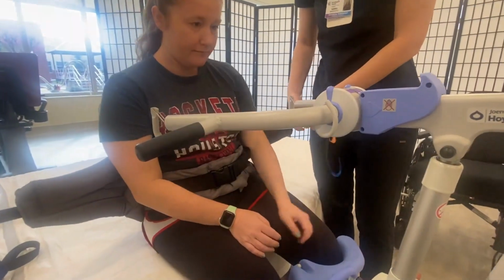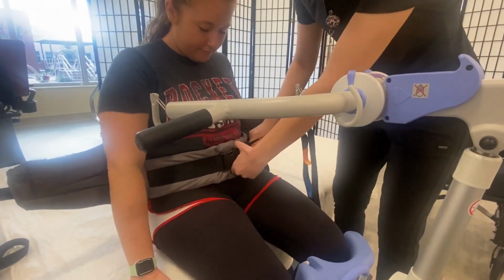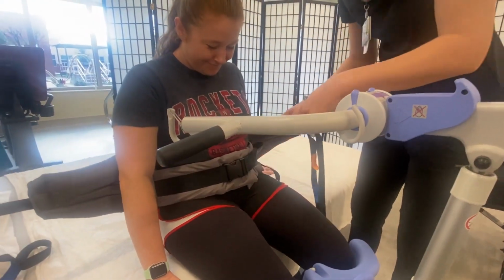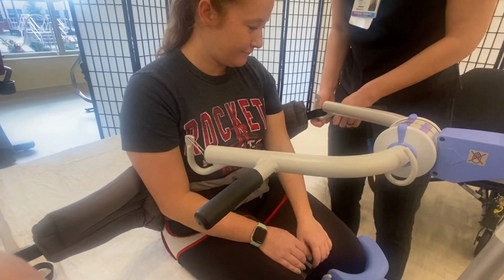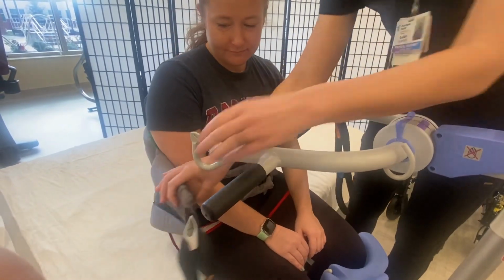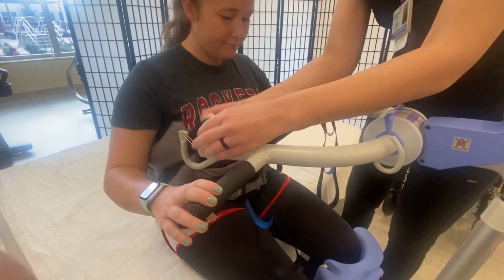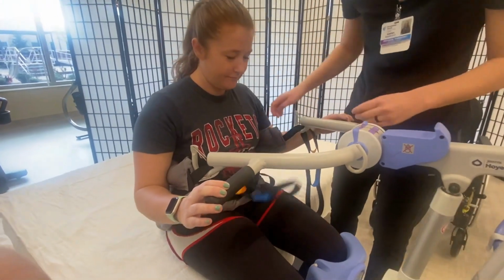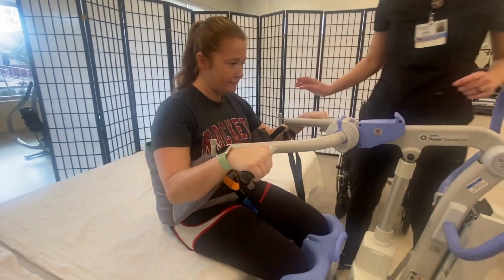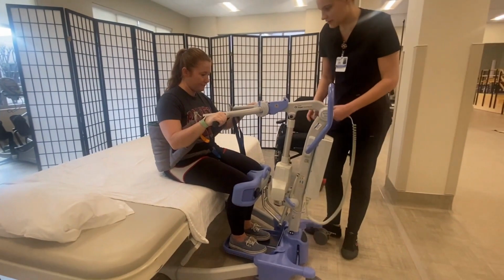Once the straps from the harness are secured to the stander, the patient is instructed to hold onto the handles of the stander and is guided into a standing position by the healthcare worker. The stander is able to be unlocked as the patient is then able to be transferred from place to place.